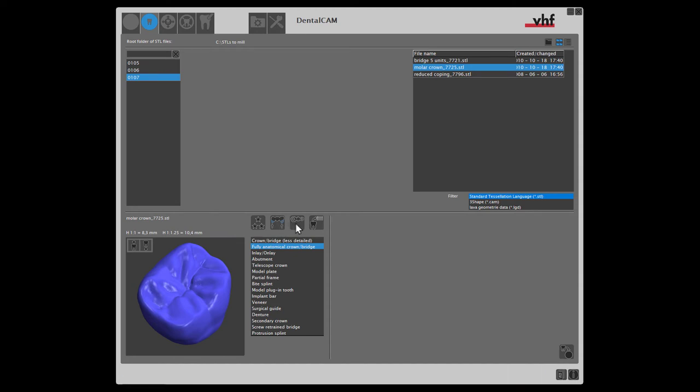With this icon, we can deactivate or activate the detection of drillings. As our selected STL file has no drillings, we deactivate this feature, so that dental cam will not spend time searching for non-existent drillings.